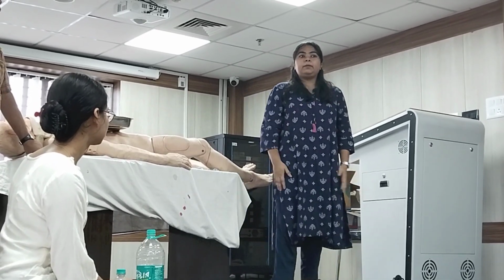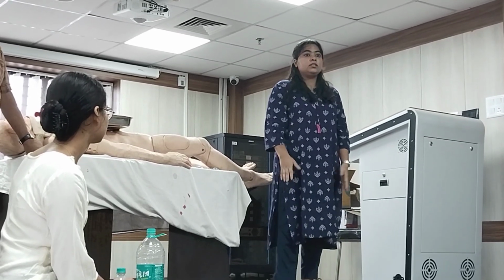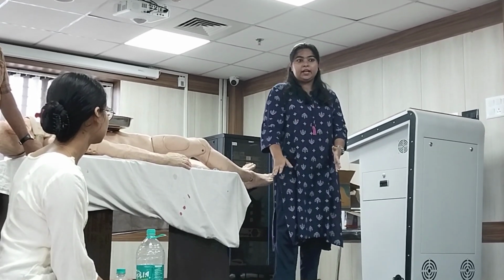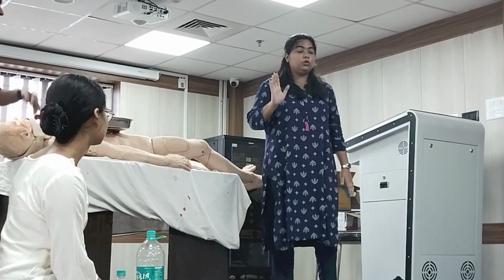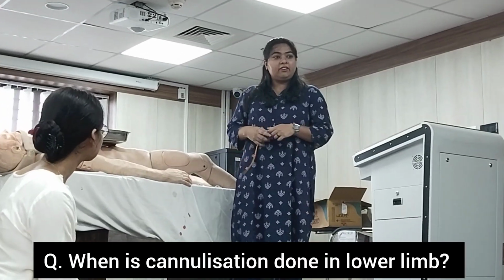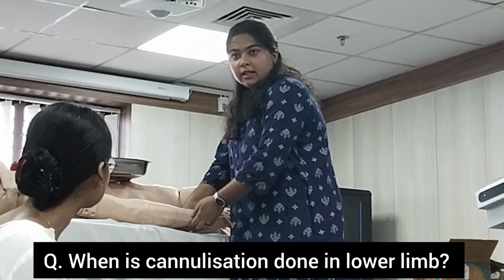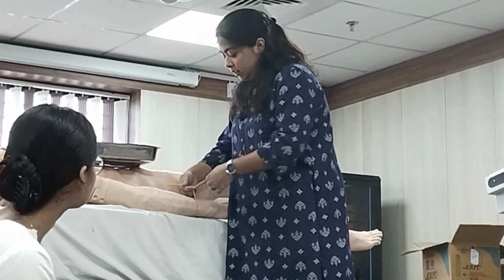For all practical purposes, we do not do cannulas in the lower limbs, because there are certain complications that come with it. There may be one or two indications for doing cannulas in the lower limb that we'll get to know in the medicine book. After that, anyhow we have chosen the vein. The sterility has to be maintained. Explain the procedure to the patient.